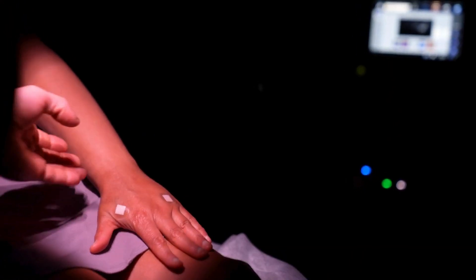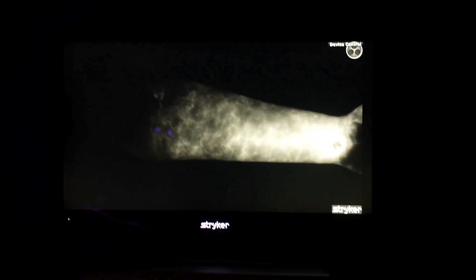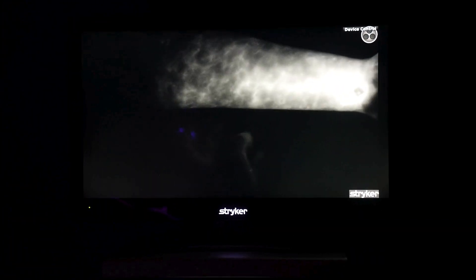Lymphatics are everywhere in the body, and you can see I'm just doing very gentle massage. The faintest massage really does help clear lymphatic fluid. Here you can see a lot of dermal reflux — you don't really see any motion of lymphatics, although we were talking earlier that lymph is getting out of here somewhere. It's just getting out very slowly, and above the level of the elbow you're really not seeing much.